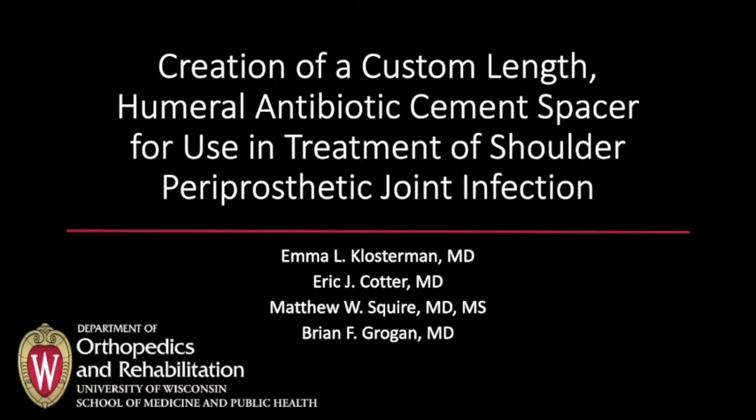This video demonstrates a technique for creation of a custom-length humeral antibiotic cement spacer for management of shoulder periprosthetic joint infection.